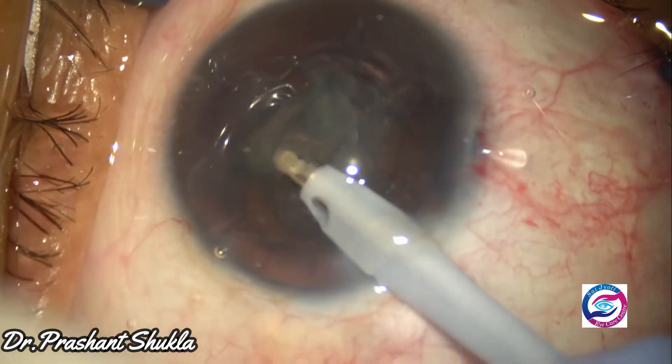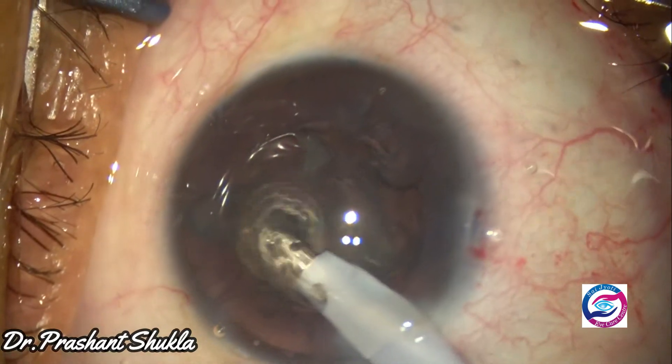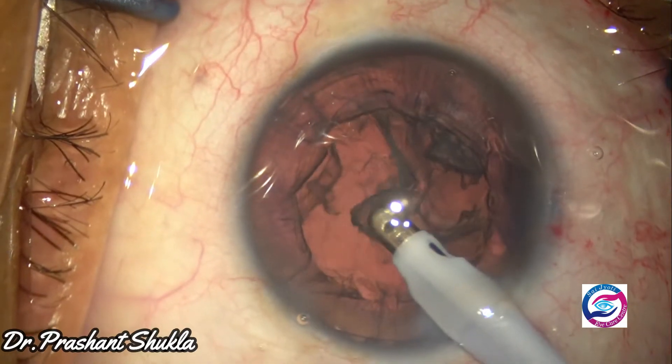Now with the help of a coaxial irrigation-aspiration handpiece, the remaining epinucleus and the cortex were removed comfortably.